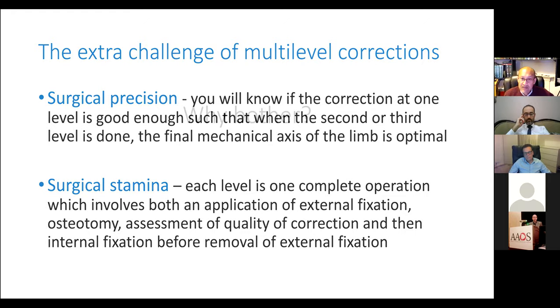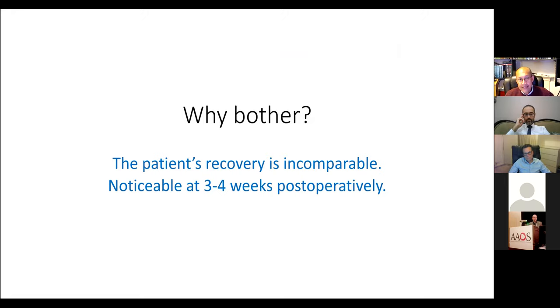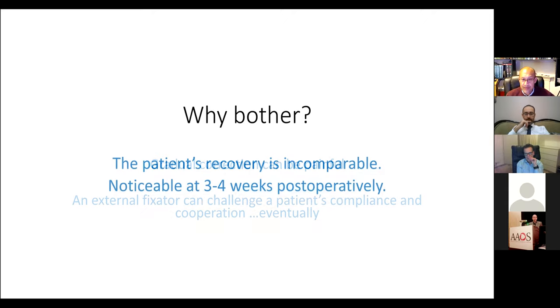Now you may ask yourself, why bother? And the answer is very simple. There is a big difference in these multi-level corrections when using internal fixation and acute correction in the patient's recovery. And you can see this usually by the time 1 month has passed from the time of surgery. The patients are rehabilitating in a much more enhanced way than compared to an external fixator that runs from the femur all the way across the knee into the tibia.